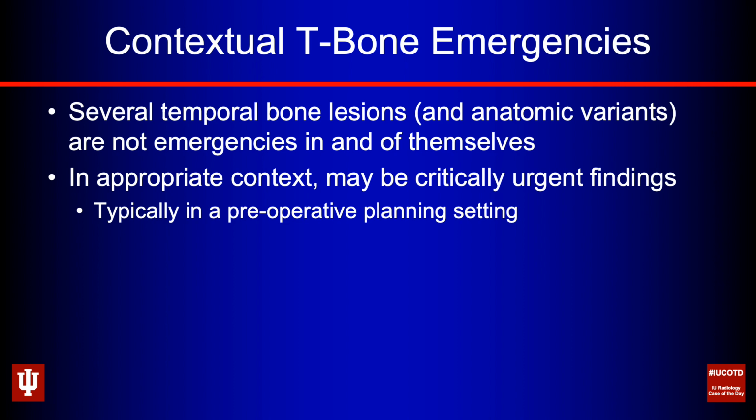At my center, we end up getting a fair number of same-day stealth imaging sequences or volumetric sequences that the surgeons use for intraoperative guidance, or maybe they get them a day or two ahead of the surgery, but they oftentimes get them close to the surgery. And that is why you need to hand these findings off to them to make sure they know about it, to avoid any critical injuries or ramifications for the surgery. The other thing is sometimes some of these variants will mimic pathology as well.